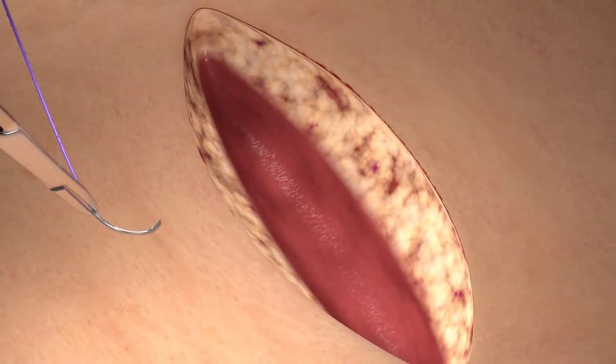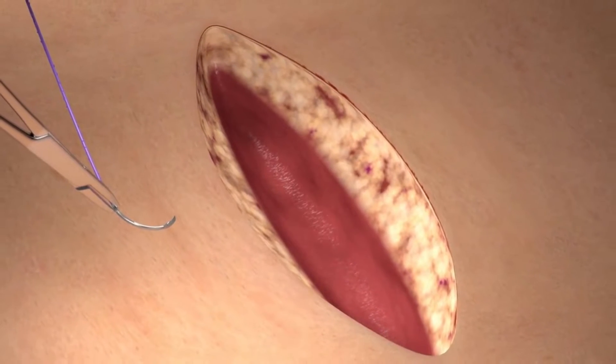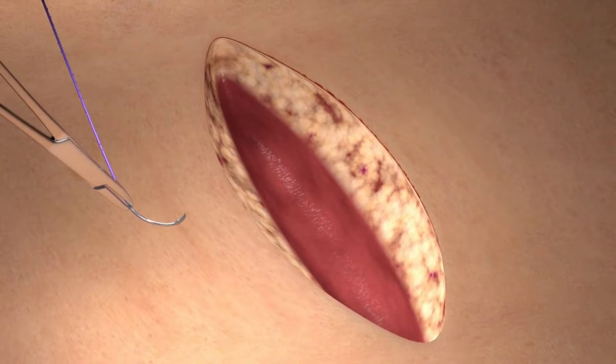Here we are looking at a deep layer wound after defect excision. We will be approximating the deep dermal layer with a Quill PDO device.